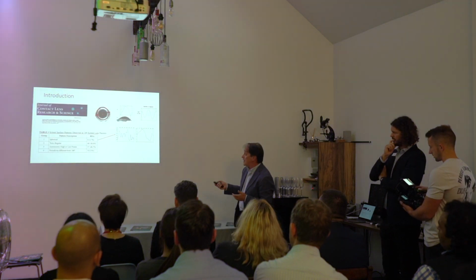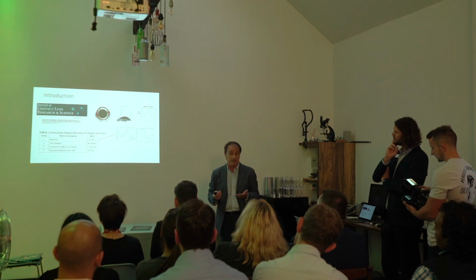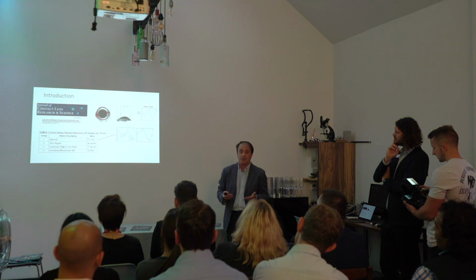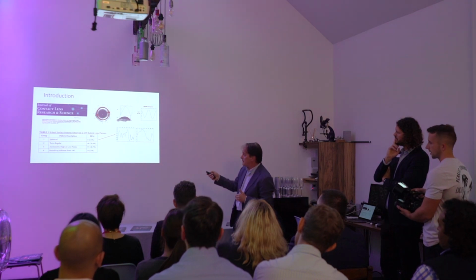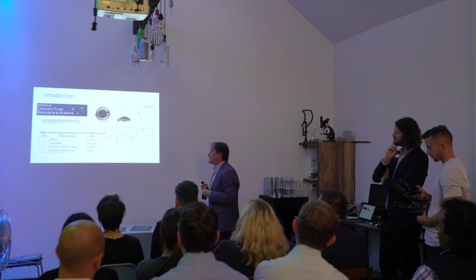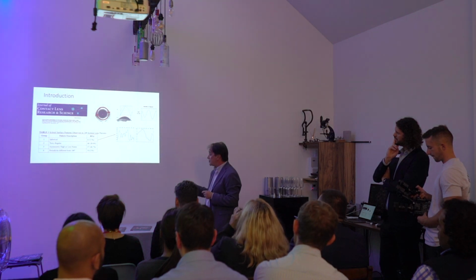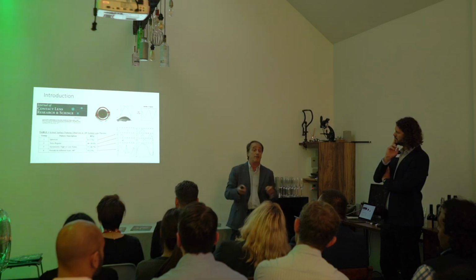For sure, we have different behavior in the sclera. We can use just topography to understand what's happening in the sclera. This is a very interesting paper published in Contact Lens Research and Science, where researchers found different behavior in the scleral profile.